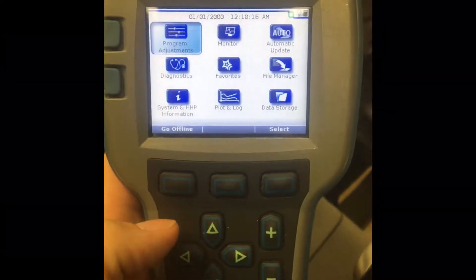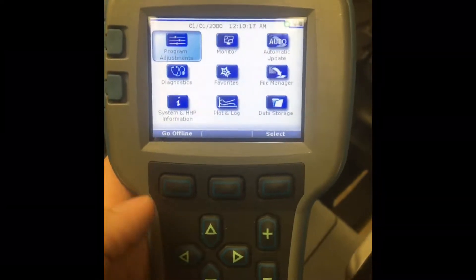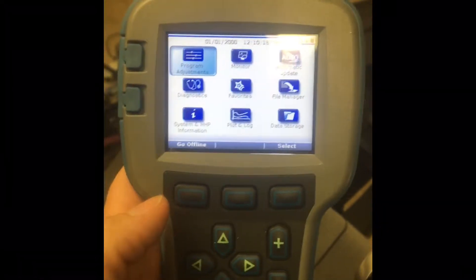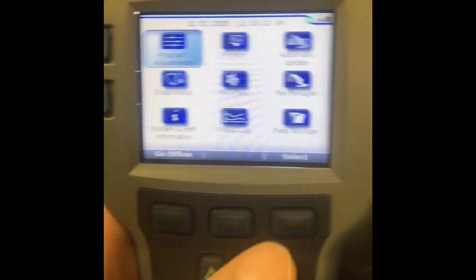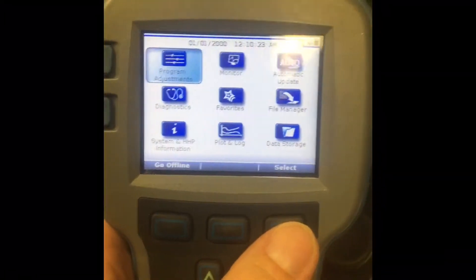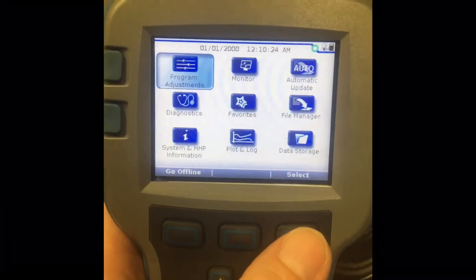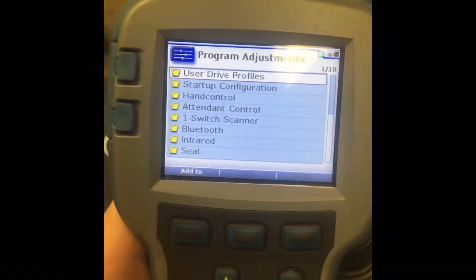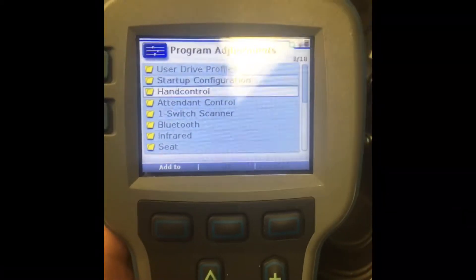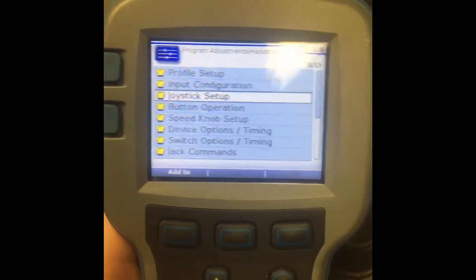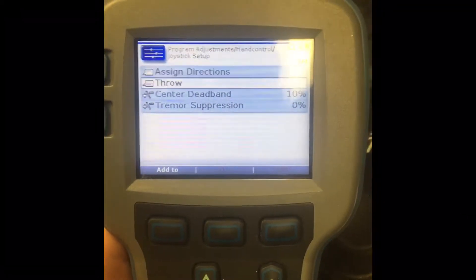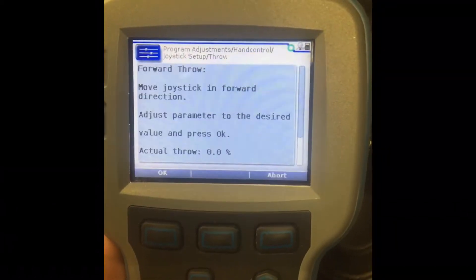Using the Quantum Handheld Programmer for QLogic 3, here's how you would adjust joystick throw. Program adjustments, hand control, joystick setup, and throw.